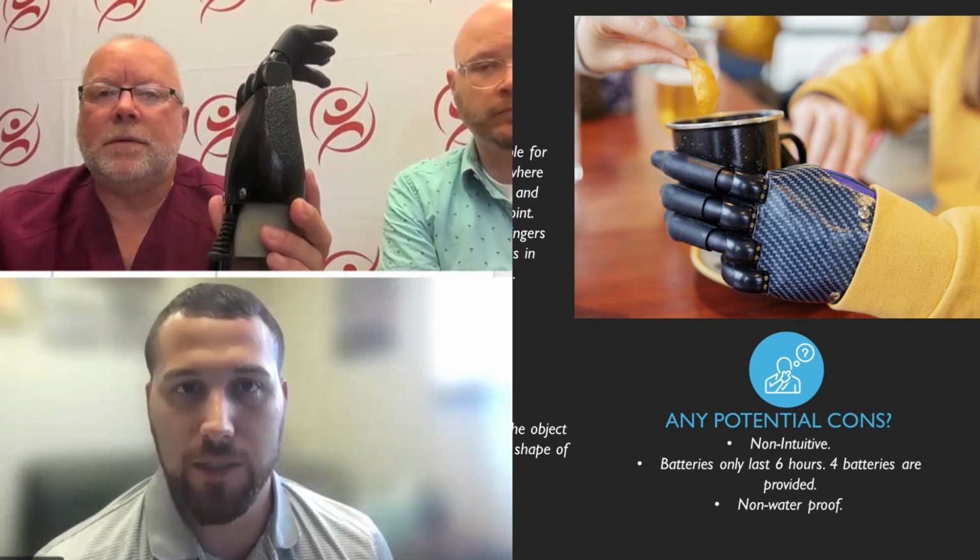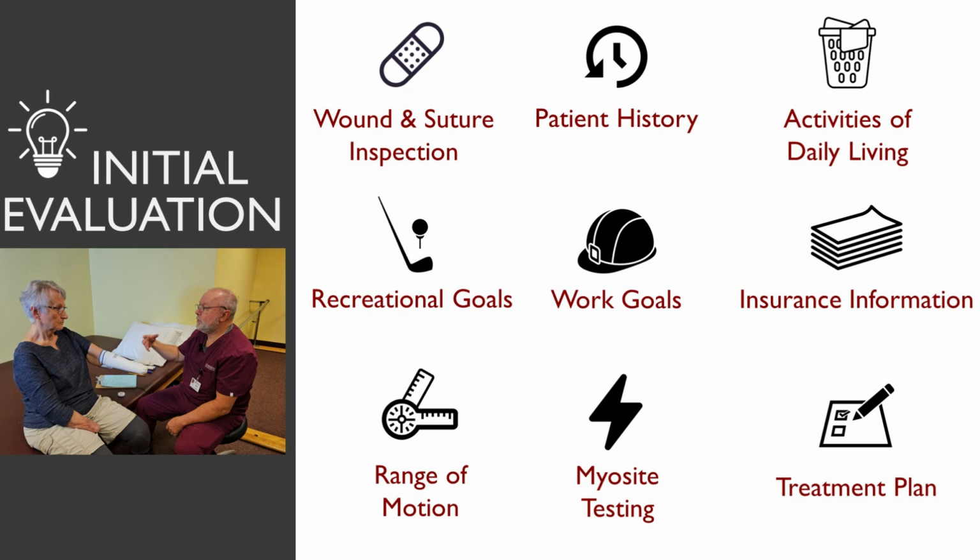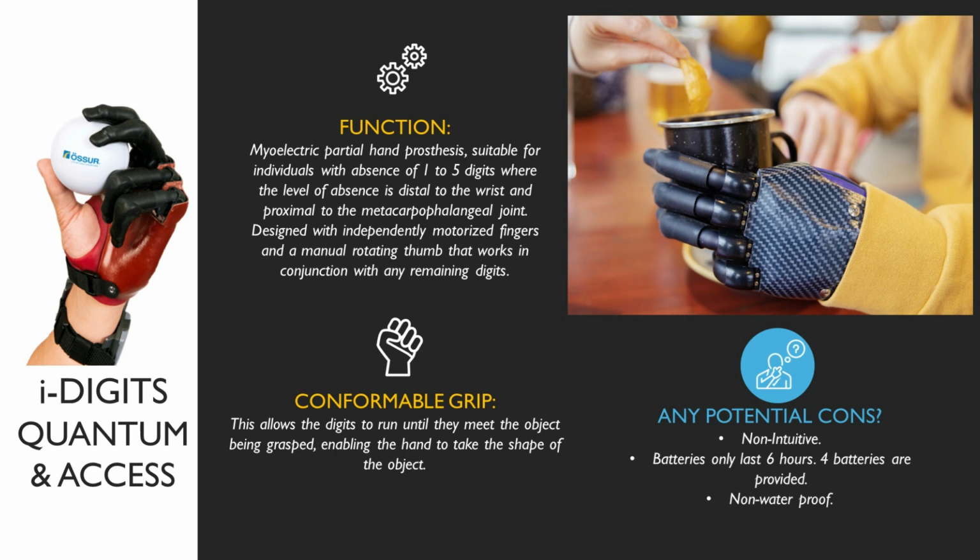It stated myo testing. So there'll actually be a myo device where we can assess that patient's ability to send that signal and what strength that signal is to operate this device, and then get further training in OT. So that device connects to an iPad to a program where the electrode gain can be raised and lowered, so can the threshold.